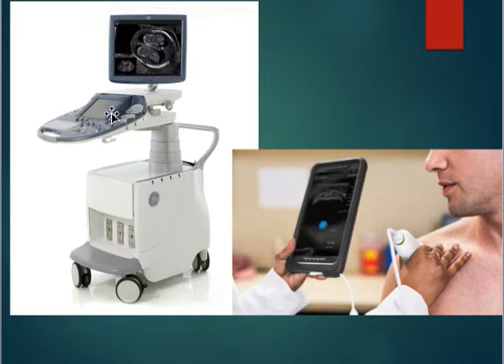These are a couple different types of ultrasound machines. So this one here is the standard one that you'll see at hospitals. There's a lot of variation that comes with the machines, but they all have very similar features. So these can be moved, they're on wheels, you see, so they can be moved around in the room and they can be moved around in the hospital. They can be taken to the emergency room, they can be taken up to the floor, right to the patient's room, so they can help do scans or help with procedures right in the patient's room.